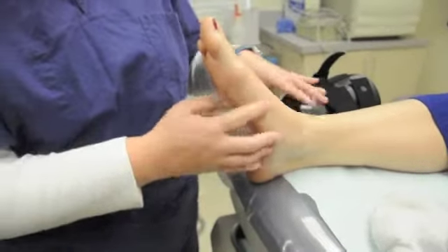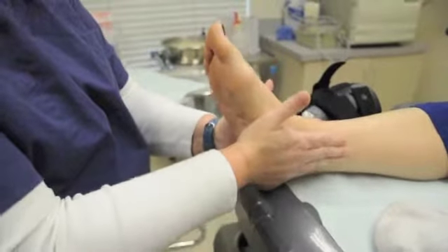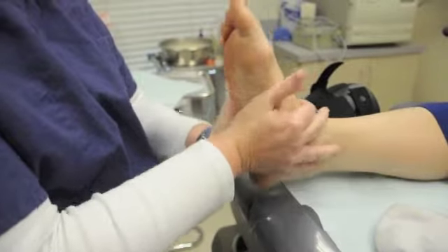What this brace does is actually give them side to side support so they can't walk like this. They can only do ankle motion like this — up and down.